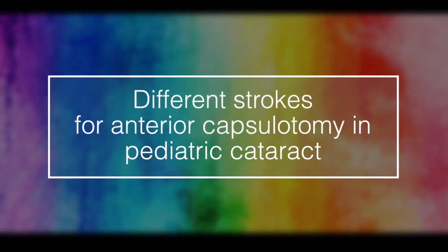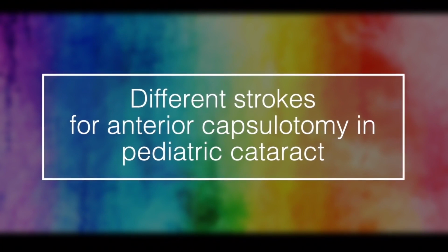This video highlights the 10 different techniques of anterior capsulotomy which can be used based on a case scenario.